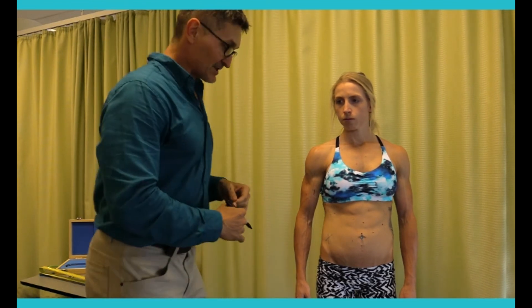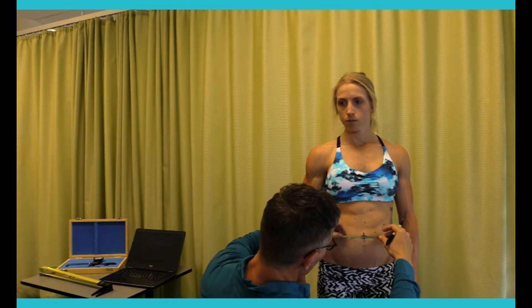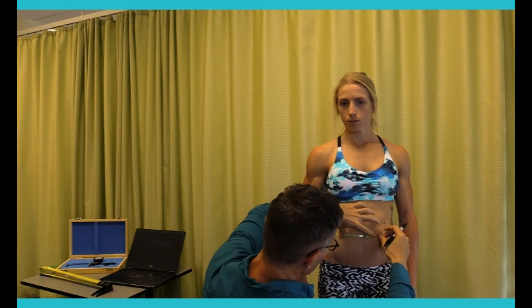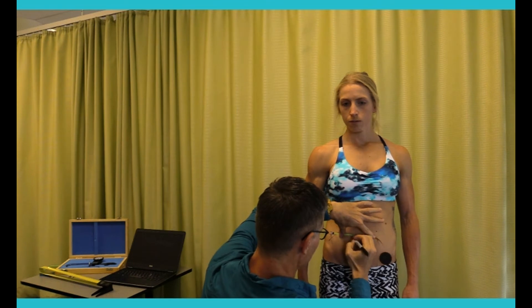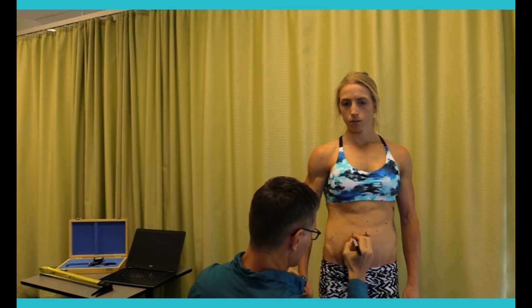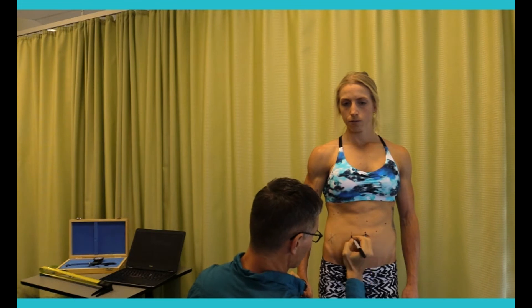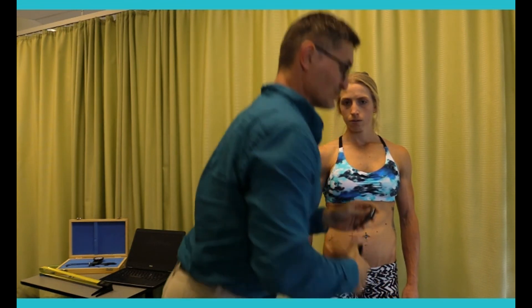It's relatively easy to find. We simply find the omphalium, which is right smack bang in the middle of the belly button, and we transfer a line across at 5cm. If the subject is significantly shorter or taller than around about 170cm, then we would adjust that accordingly. But in general it's a skin fold taken 5cm from the middle of the belly button, or the omphalium.